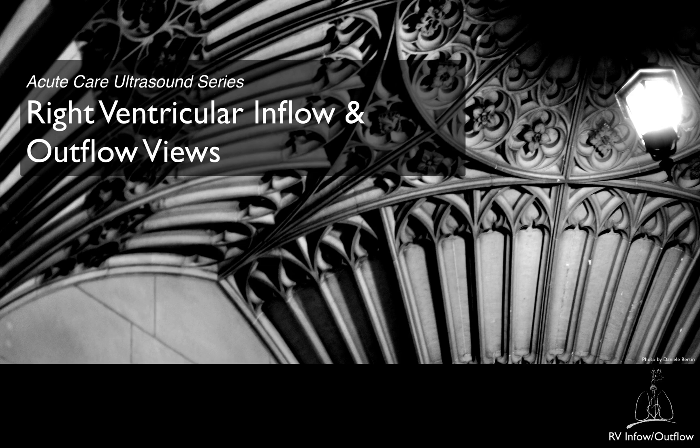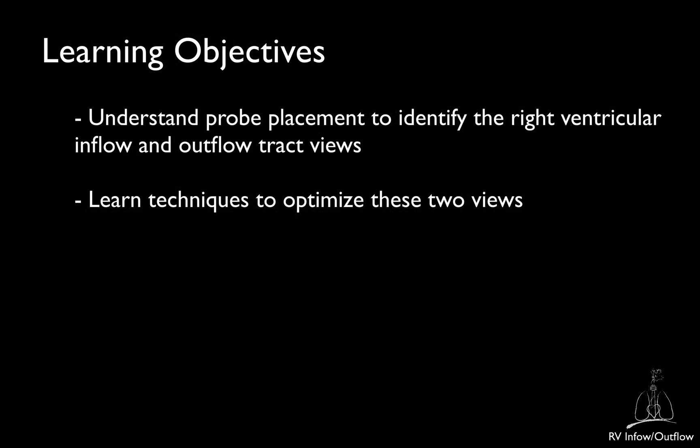The purpose of these videos is to standardize the performance of transthoracic echocardiographic studies and to help the learner optimize and troubleshoot image acquisition. This video will demonstrate how to obtain the parasternal right ventricular inflow and outflow views. The second part of the video will provide tips on how to optimize the two views.